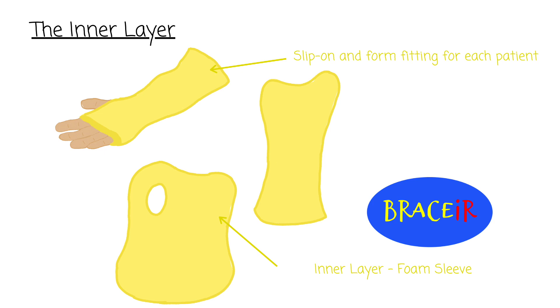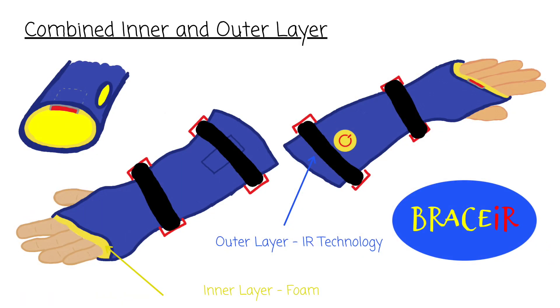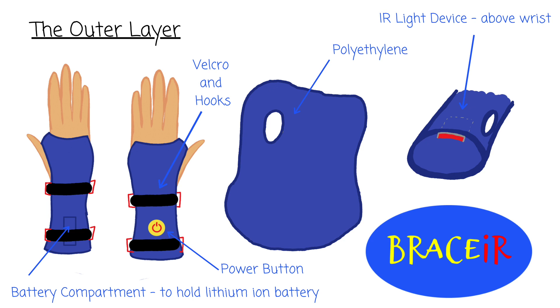Our solution first starts with an inner foam layer, which would be disposable and replaced with every patient or hospital visit for hygiene purposes. The layer fits over the hand and forearm with an opening for the patient's thumb. The rigid outer shell is then placed over the inner layer and secured with velcro straps. The outer layer is made of a hard plastic shell used to immobilize the fractured bones. As you can see on the top right, the IR light device to stimulate bone healing and circulation is embedded into the shell and placed directly above the injured area.